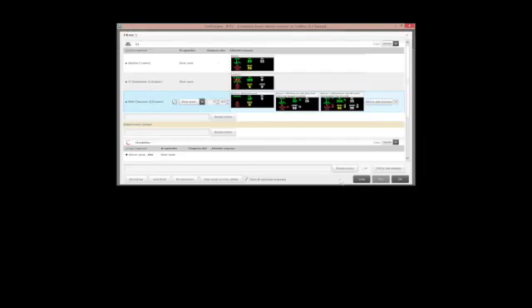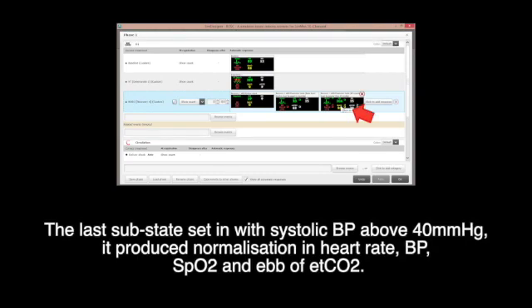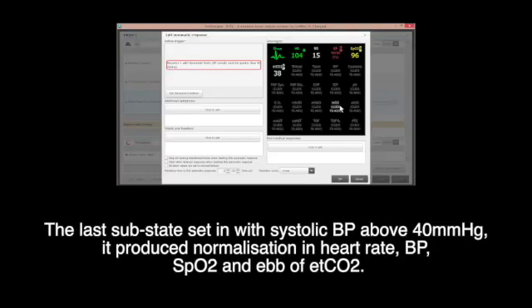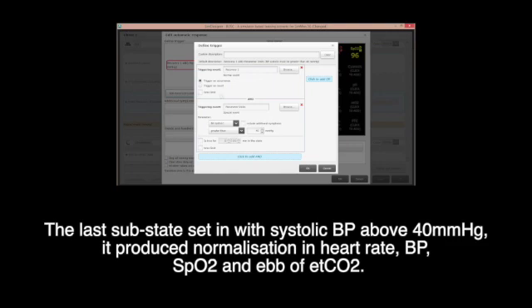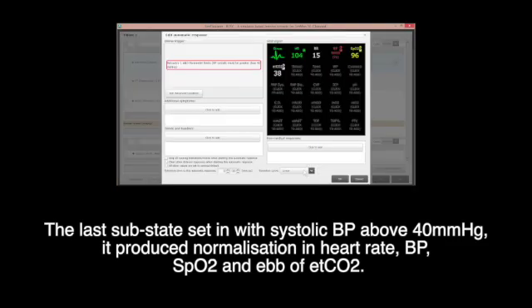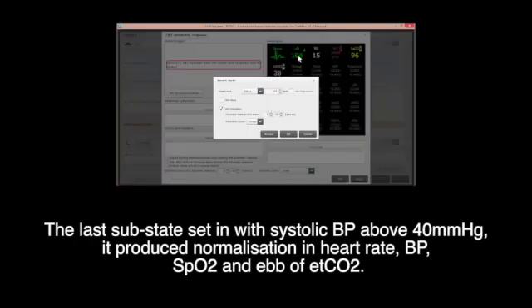The last substate sets in with systolic BP above 40 mmHg. It produces normalization in heart rate, BP, SpO2, and abatement of end-tidal CO2.